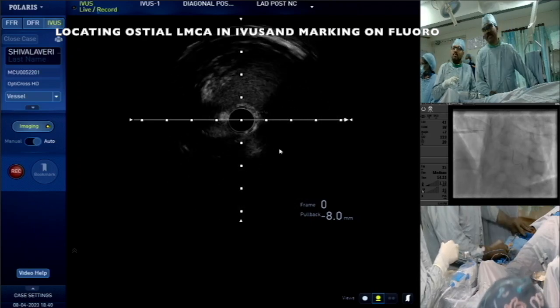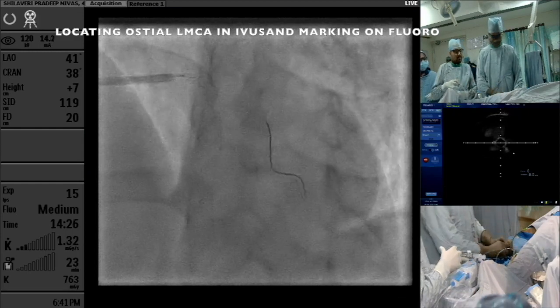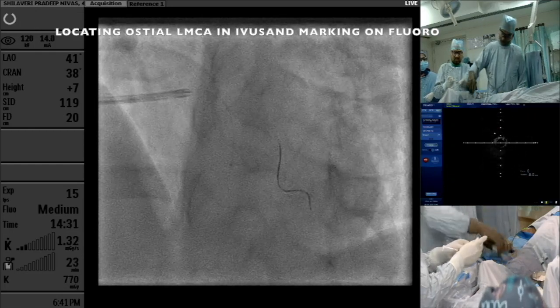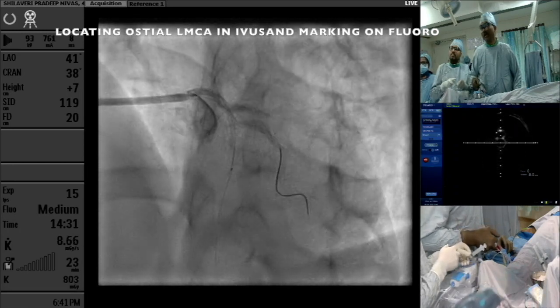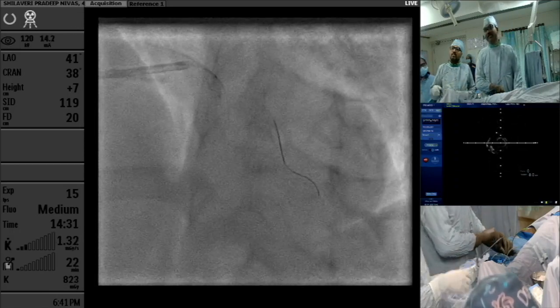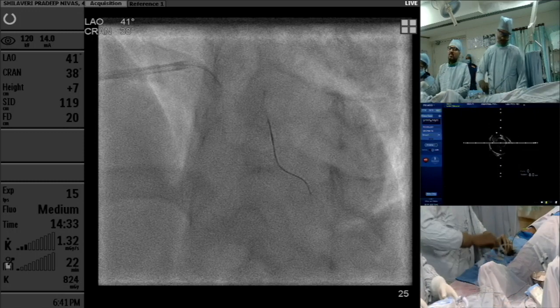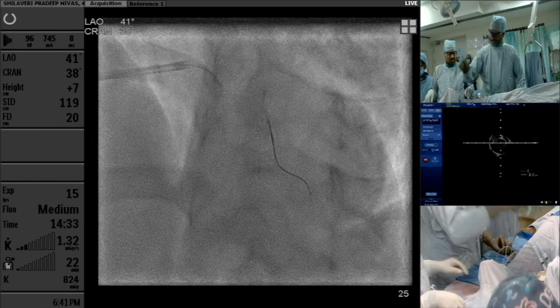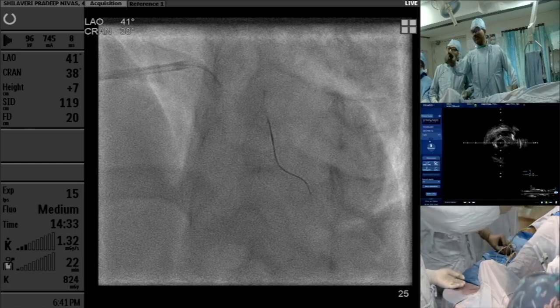Yes, yes. And I'm taking first proximal stent. As I already explained, why I'm taking proximal stent first. The most important reason here is, I'm just again locating, sorry. Yes, this is where I have to end. See, the most important reason is, we can't fix two ends of stent, right? So if I have to stent proximal second, my distal end is fixed, proximal end is fixed. Okay. And I cannot overlap stent onto branches.